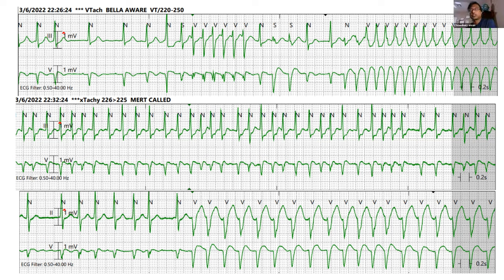And then this long-short concept, Rafique Bhai: if there is any aberrancy in AFib with aberrancy, do you see a change in axis, or is it just aberrancy taking a change in morphology, like it becomes an aberrant bundle branch? But okay. You don't see any axis change.